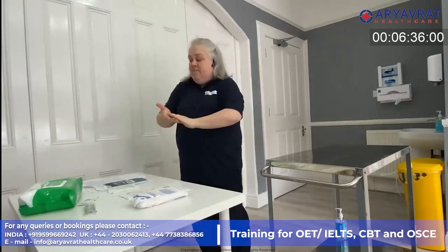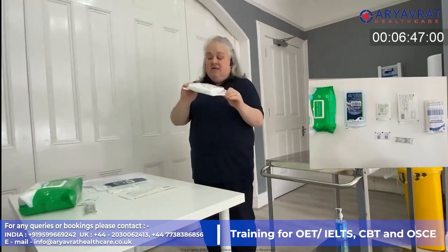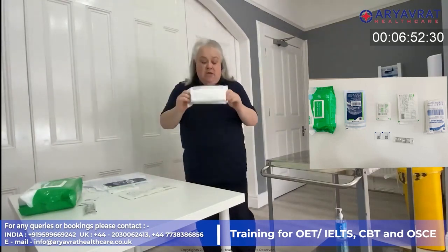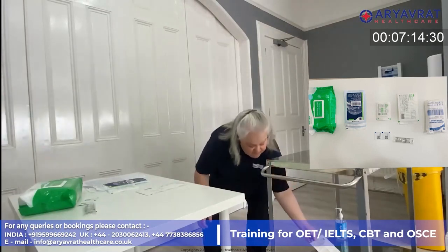I'm going to gather the equipment I need for the procedure, and for that I need a wound dressing pad. Need to check that it's intact and in date, expiry date 07/2022, and I'm going to place that on my trolley. I'm going to get the right size dressing, which I've confirmed with the wound care plan. So I've got a surgical dressing here and the right size. Checking that it's intact and in date, expires 11/23.